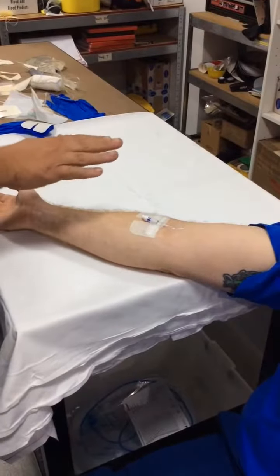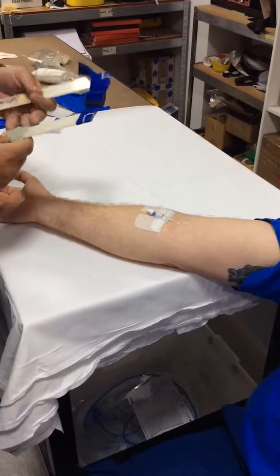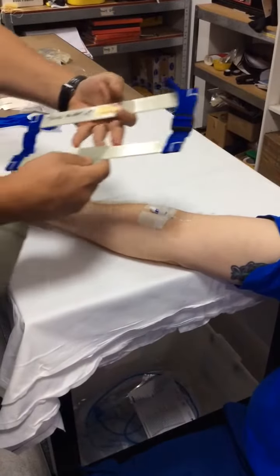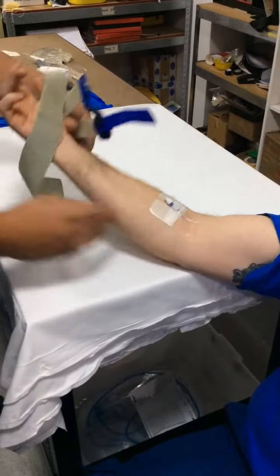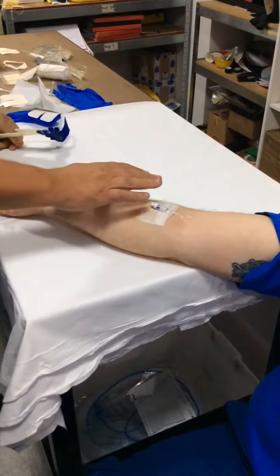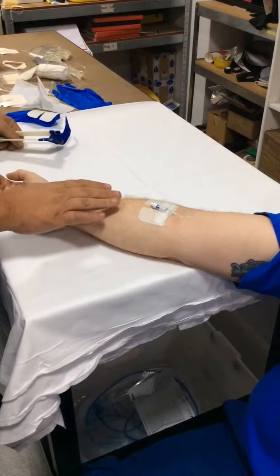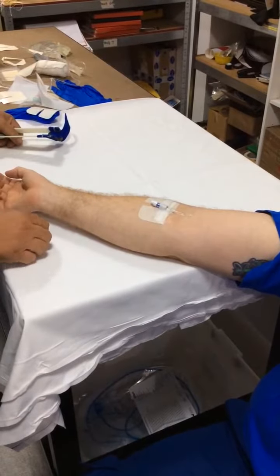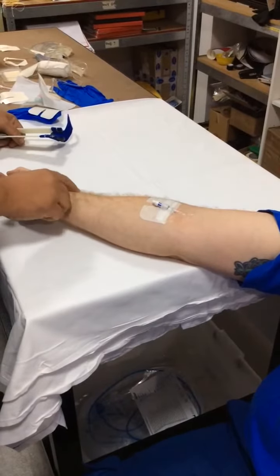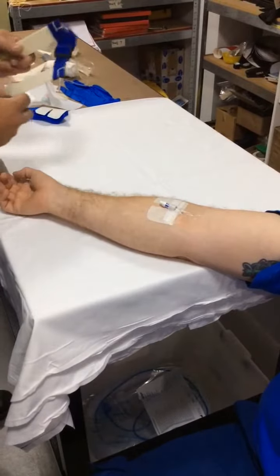Today we're not going to talk about cannulation, because that's already well covered elsewhere, but securing a cannula in a mobile area such as the cubital fossa, and securing the pump set line and the fluid line, so it doesn't get dislodged later on downstream on the job. Number one: if you can go for a cephalic, go for a cephalic over the cubital fossa, because you don't have the mobility issue.